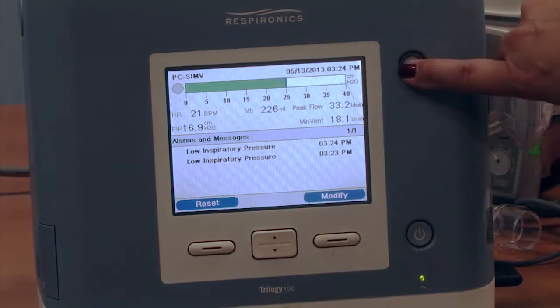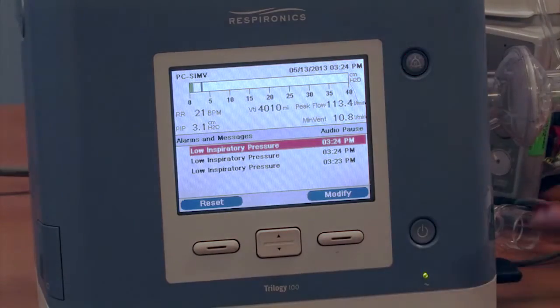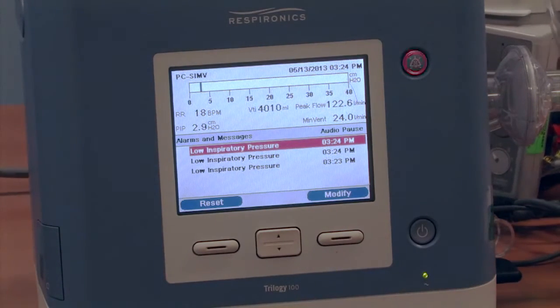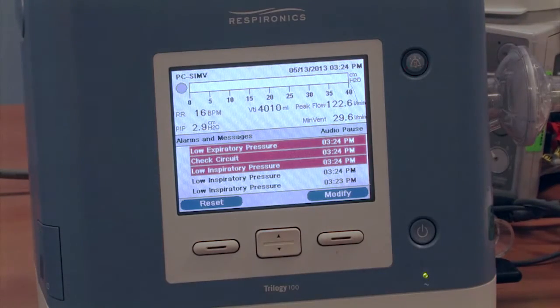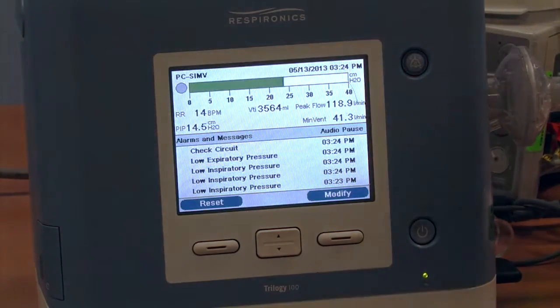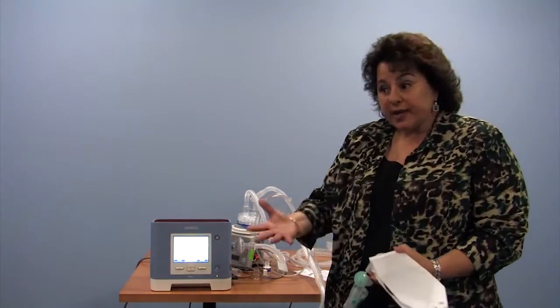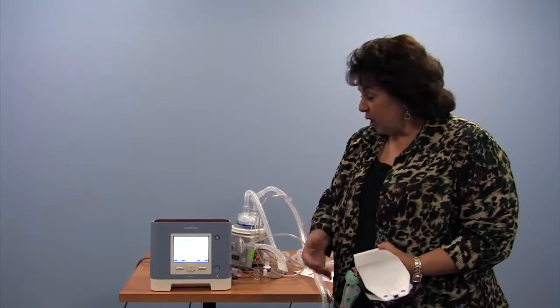You can also silence the alarm so that you don't hear it when the child becomes disconnected, but the machine still shows you the red. If you hit the silence button and go do something, it will take the 30 seconds or so for the machine to go back into full alarm mode and let you know. So you don't want to do that when you're going to leave the room. Most people do tend to silence alarms before they're going to disconnect to keep the home quiet and not get the child or anybody else in the vicinity anxious about an alarm.